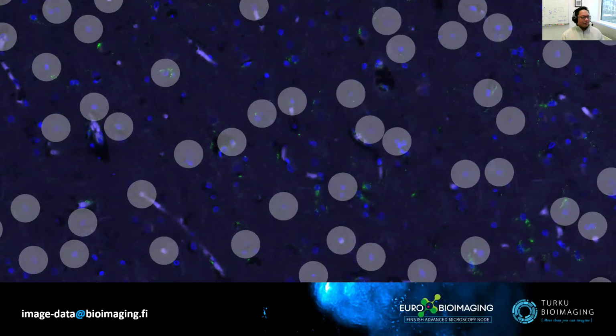So the circles are also a fixed radius around the nuclei. This is really interesting because the white circles that you see are also not raster images. They're just point coordinates, X and Y, the centroid of the nucleus, and you store that in a text file. Then if you want to visualize it, you draw a circle that is 120 pixels in radius from that center point.